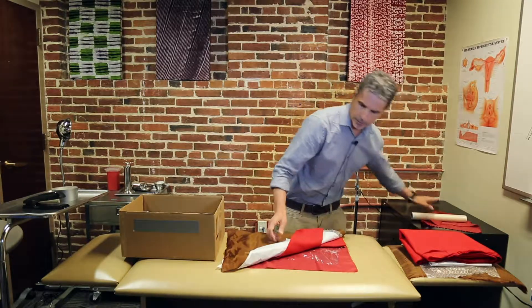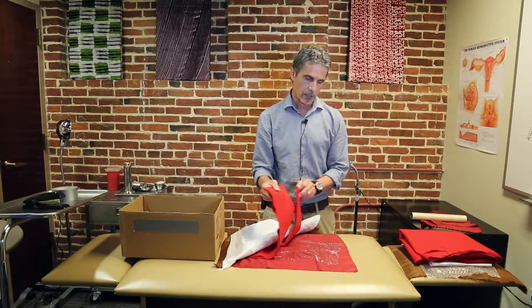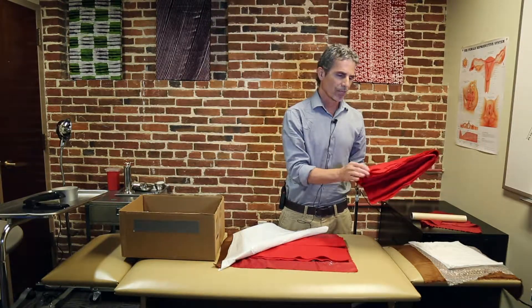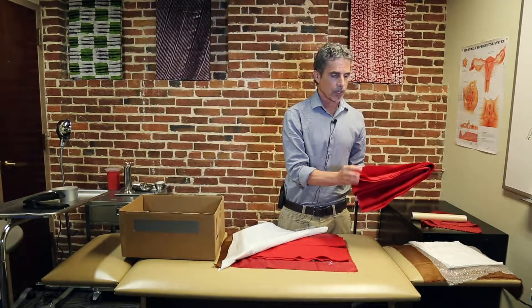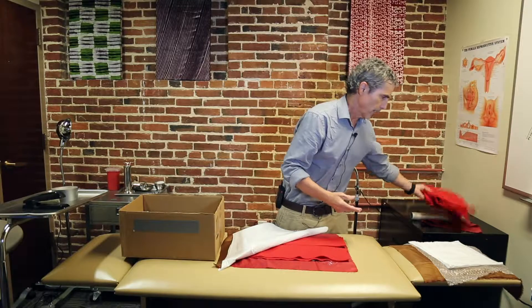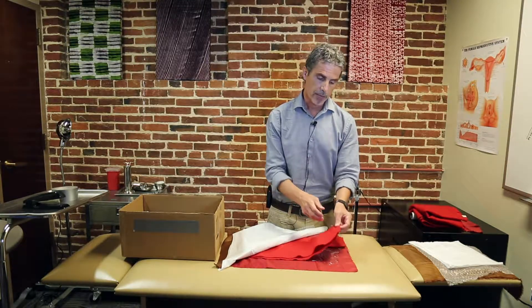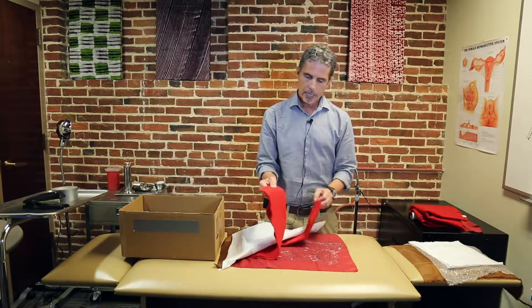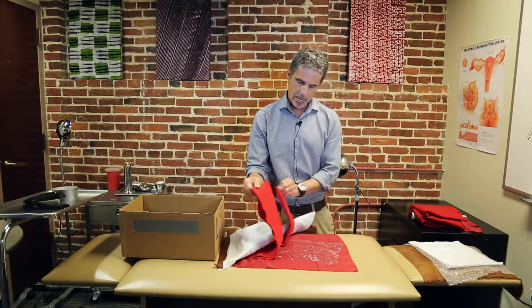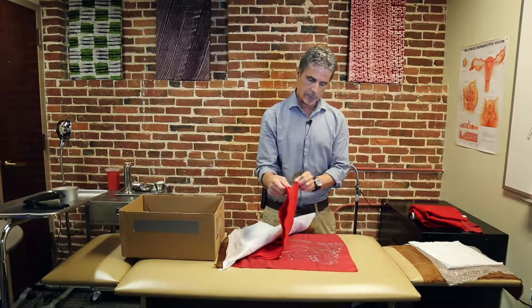The next layer is the rectus muscles. These are going to be thicker, and in contrast to the uterine layer, you want a thicker material here. What works well is a felt layer — it has that thickness that differentiates it from the uterine layer. Ideally, fold the felt over so you have that thickness to it and then staple at the end, giving you the two straps of this layer.